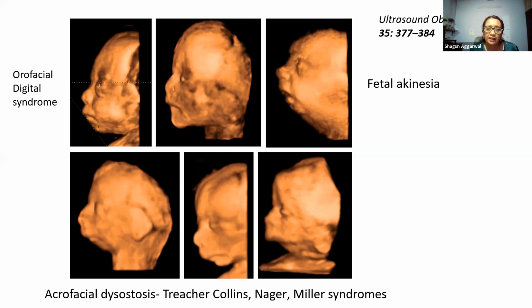So you need to be really more careful. And this is from the same paper by Dr. Palladini. He's shown these wonderful pictures of babies with micrognathia, and you can see all babies are not the same. They are different, and actually all of them have different genetic syndromes. So he has in fact listed the individual condition for each of these babies. So this is a really wonderful paper. Please do go through it.